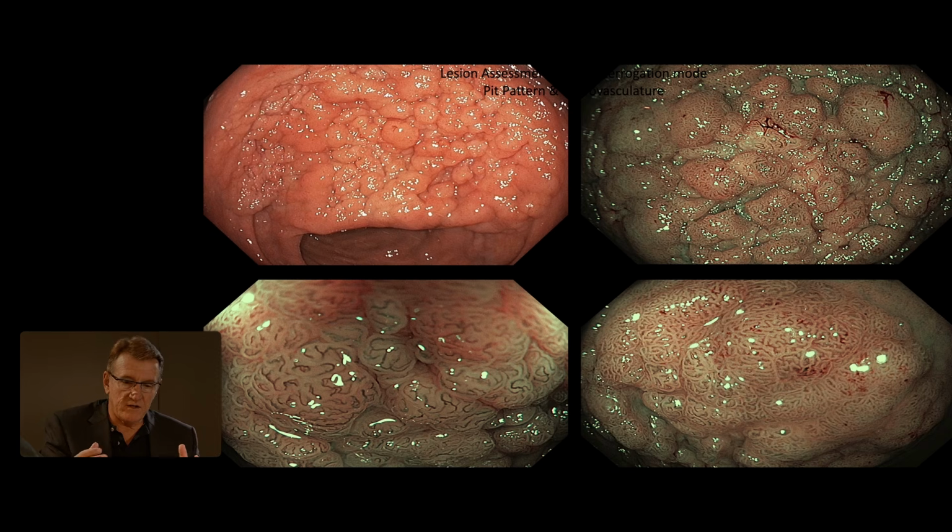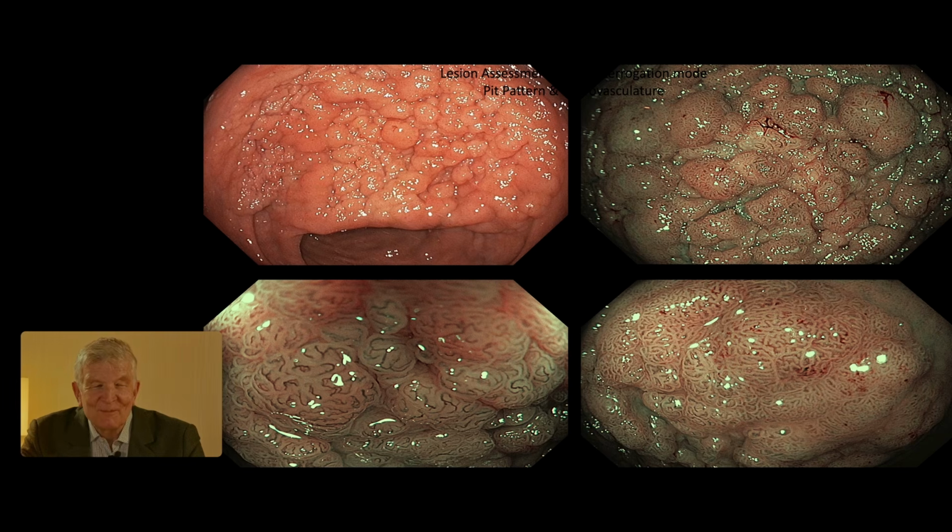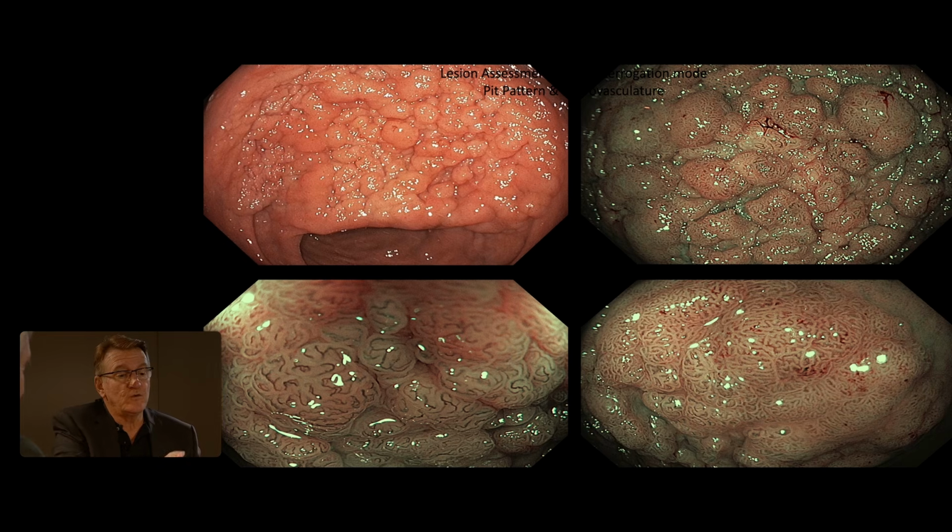And I want to get back to that idea of a flat lesion versus a lesion with a nodule or big bulky component. I like to use the analogy of the pizza versus the calzone. With the pizza, you know exactly what's in it because you can see all the ingredients. This should just be like a margherita pizza, all homogeneous. When you've got the calzone, if there's a big nodule, you don't know what's inside. So that becomes more difficult, and we have to rely on location and other factors to stratify the risk of invasive disease.